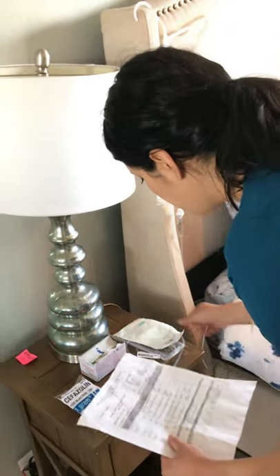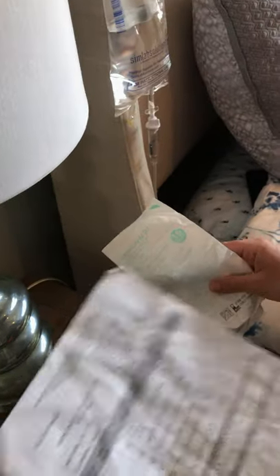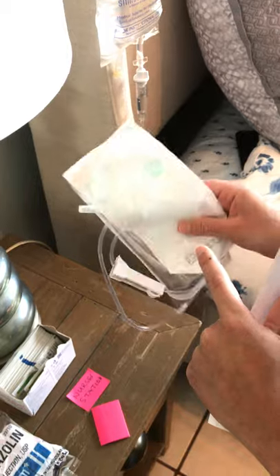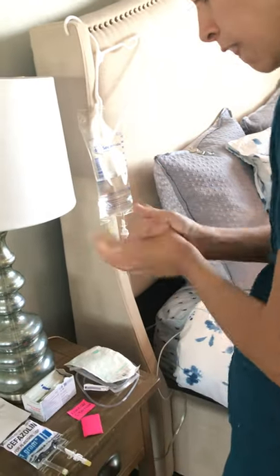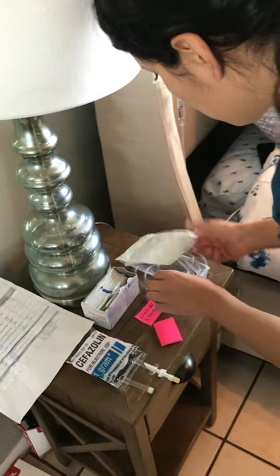Next, I'm going to show that I would be using this correct secondary IV tubing set — 15 drops per mL — because this is the correct tubing for this administration. I'm going to place this aside, wash my hands, and place gloves.